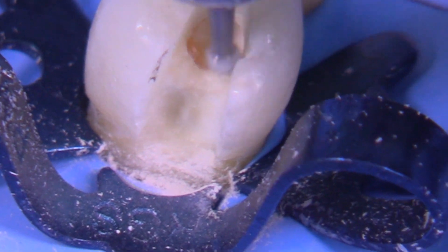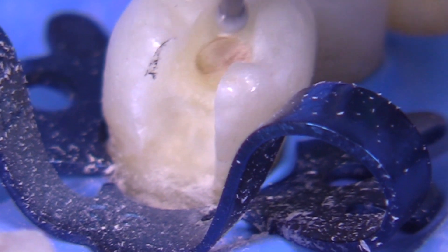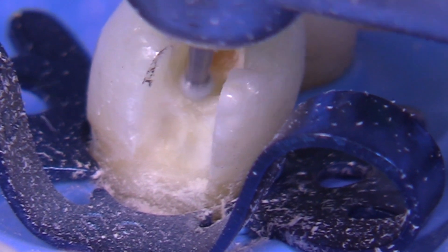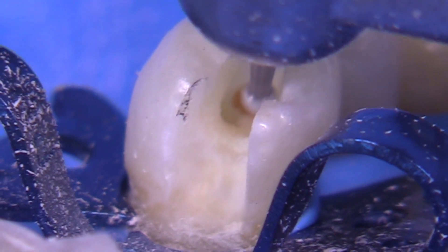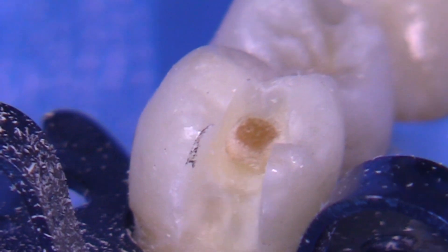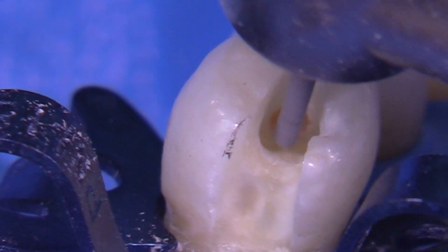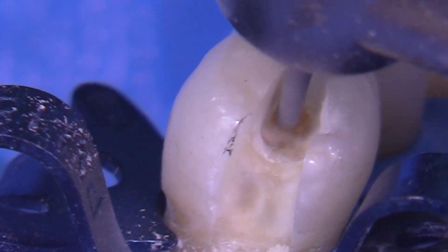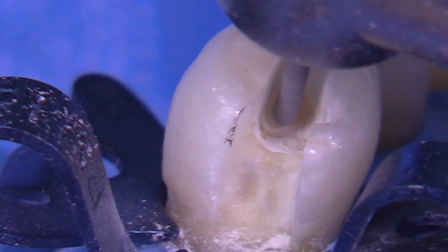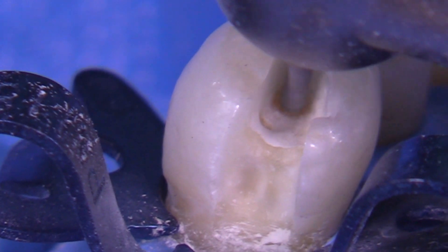In a case where we're not going to hit the pulp, I like to generally get most of the caries out. If we were going to hit the pulp, of course we would leave the caries and not get a pulp exposure. In this particular case, we are going to histologically expose the pulp — perhaps not on the pulp horn in a way that bleeds, but it will be histologically exposed. We're going to mitigate the pulp exposure and treat it with the appropriate therapeutic materials, extending the outline and then going back to caries removal — alternating between GV Black step 1 and GV Black step 5.